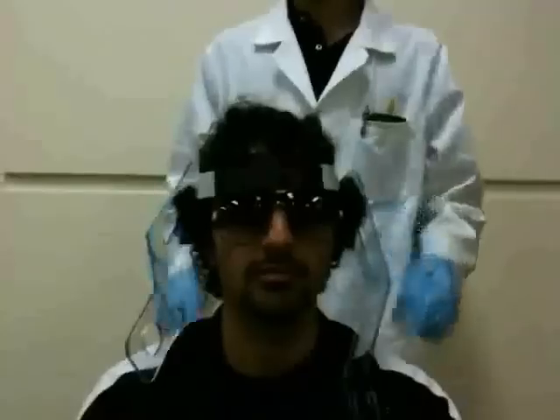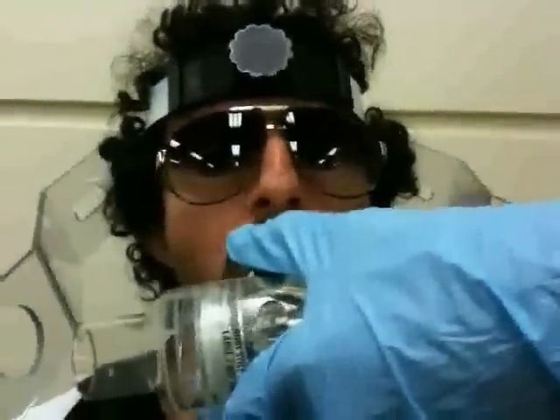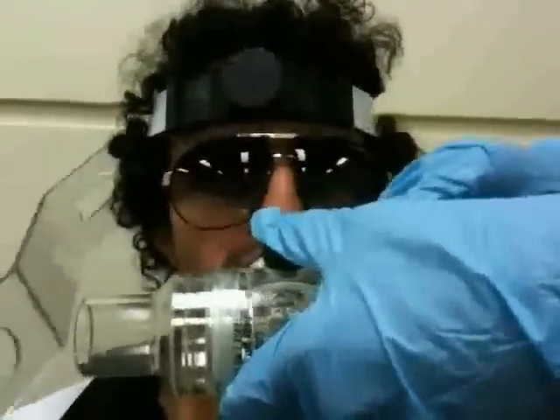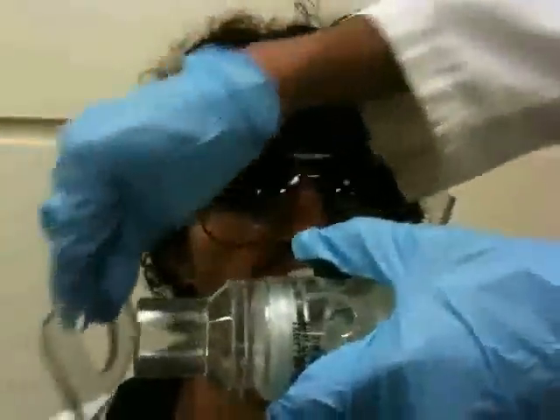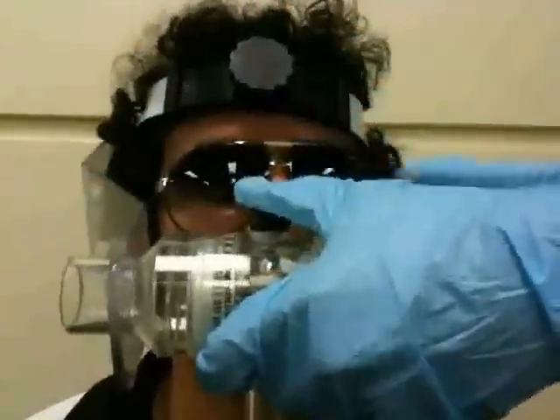The piece is placed and secured. You want a nice tight fit to make sure it doesn't come off during the run. Next, the mouthpiece is inserted inside the mouth. And finally, it is all assembled.